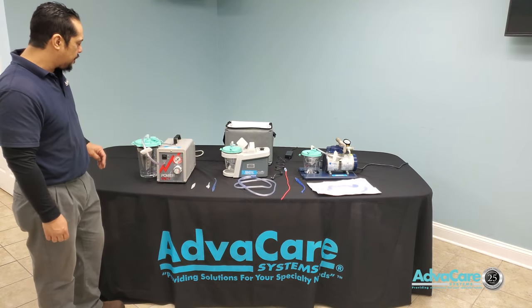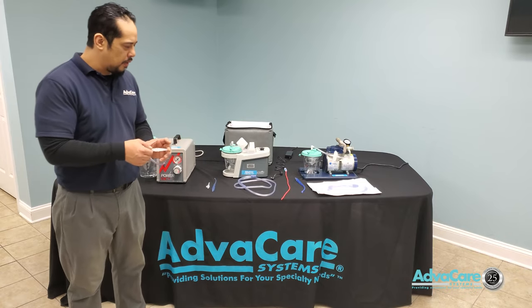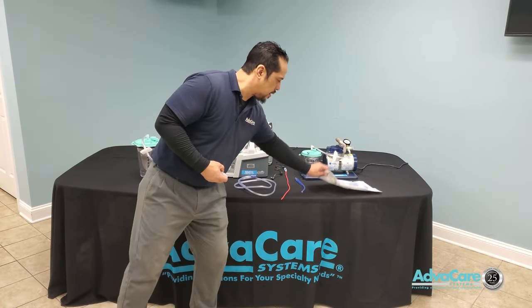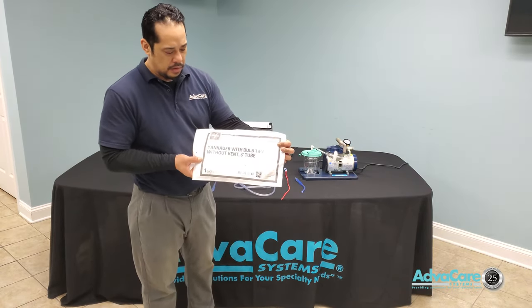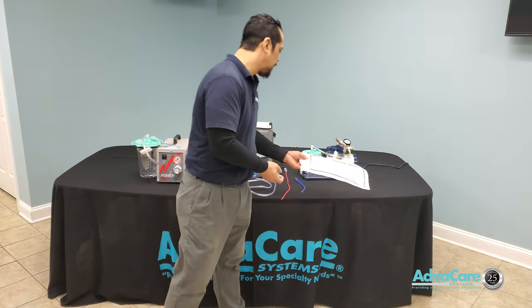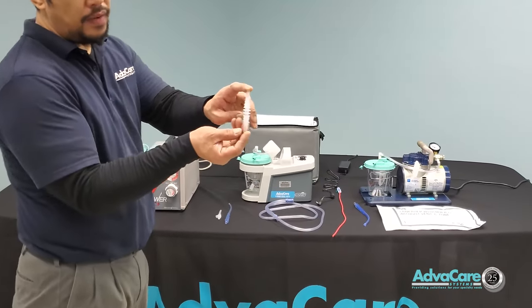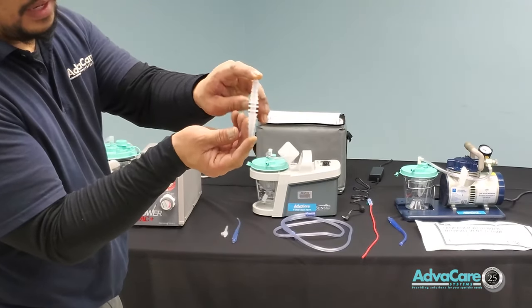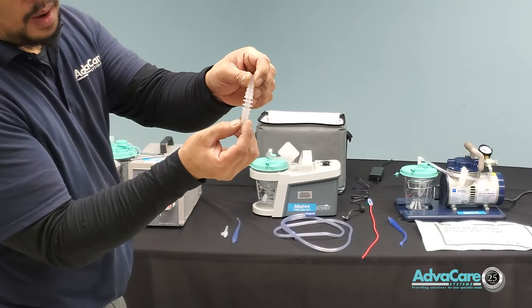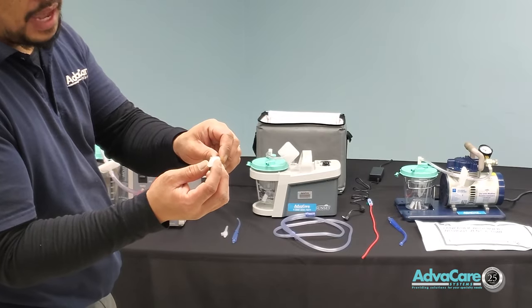The extra connector delivered along with your Yankauer with ball tip and six-foot tubing is a five-in-one connector. It has five different sized barbed fittings on each side so you can connect to different sizes of NG tubes or G-tubes fitted on the patient.